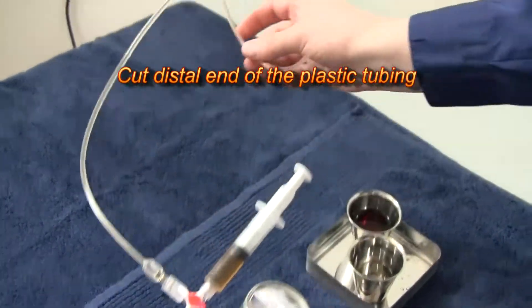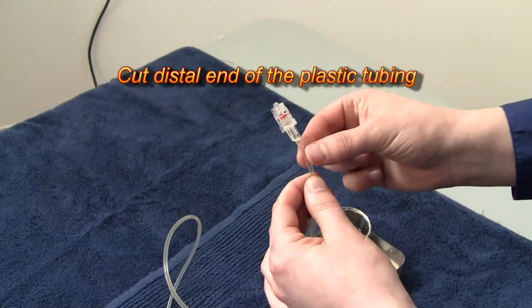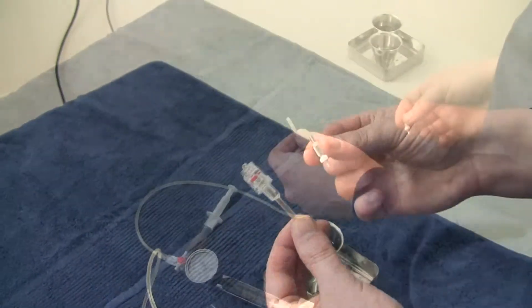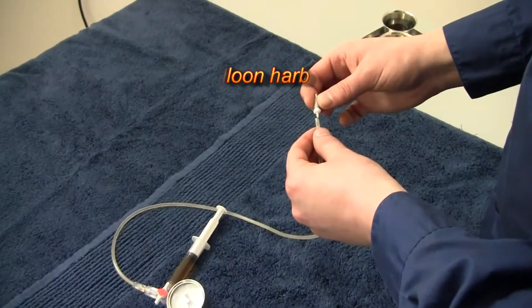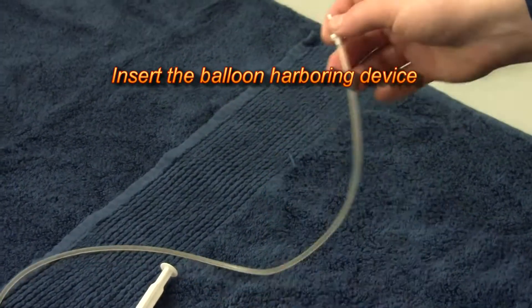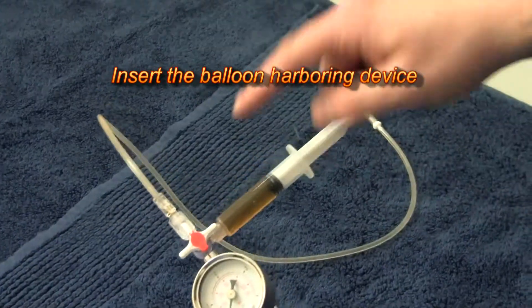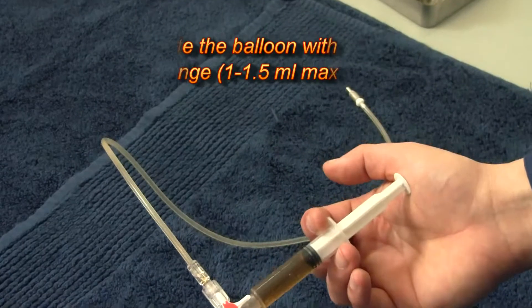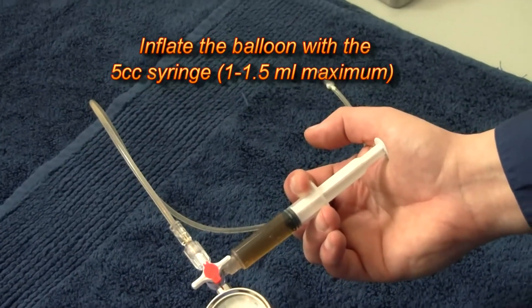Now cut the distal end of the tubing and connect to the balloon harboring device. Once the balloon harboring device is connected, you must check the balloon's integrity by inflating it with one to one and a half milliliters of contrast fluid.